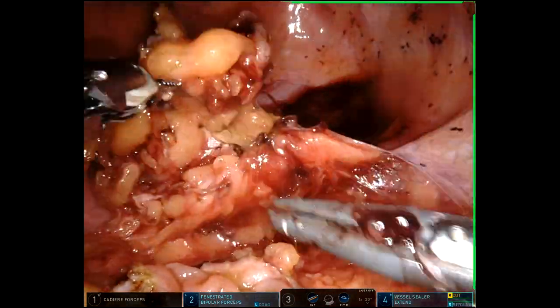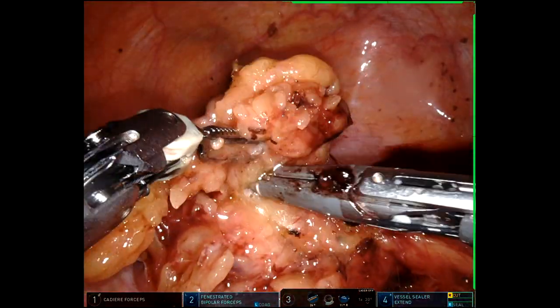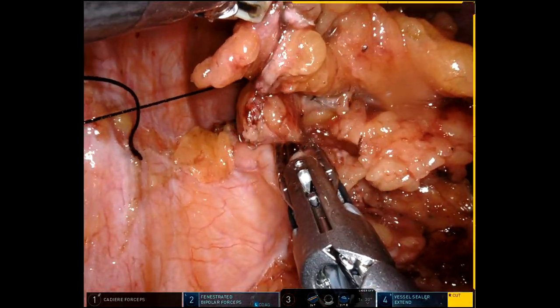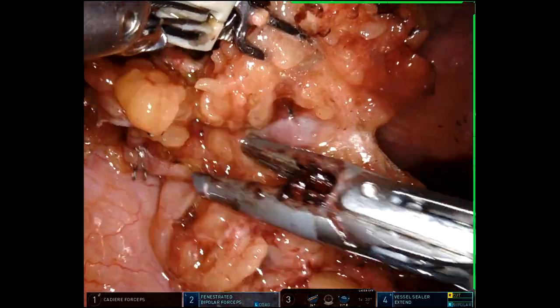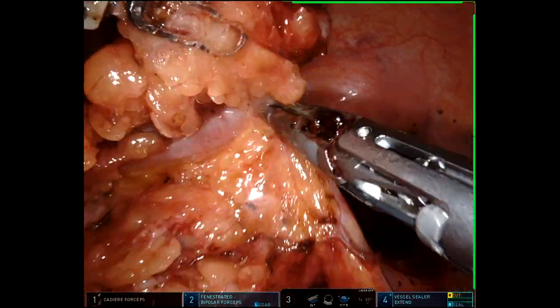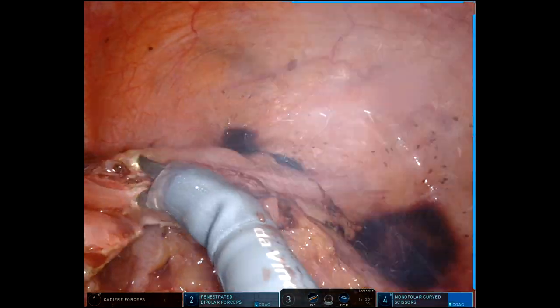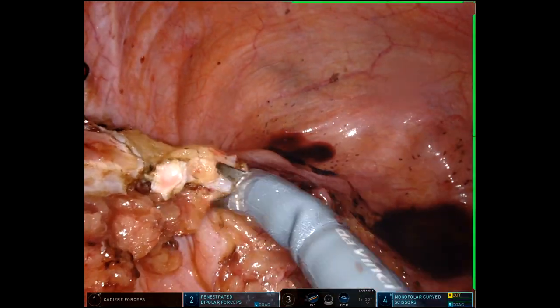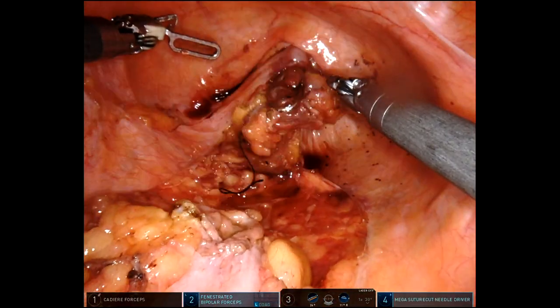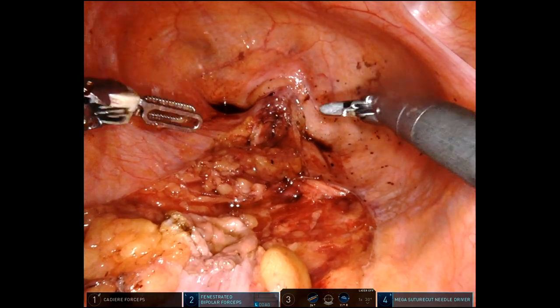Early after surgery you could theoretically have a more stenotic anastomosis with two layers, although clinically in several hundred patients I've never had that be an issue. So taking the mesentery with the vessel sealer and the bowel wall with scissors, I've already divided the proximal side and now I'm getting ready to divide the distal side and finish that off with the scissors. I'll extract that little piece through the rectum and label that as anastomosis — it also serves as a new proximal and distal margin.